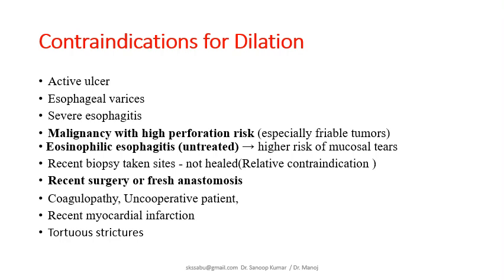Do not be hyperactive to dilate to relieve the patient's symptoms. Your dilatation in a malignancy case is only for the purpose of obtaining a biopsy. Do not dilate too much even if you are doing it for biopsy purposes. For dysphagia, dilatation is not the choice in malignant strictures. Malignant strictures should be managed either surgically, or by putting stents if they are inoperable cases. Perforation risk is very high.